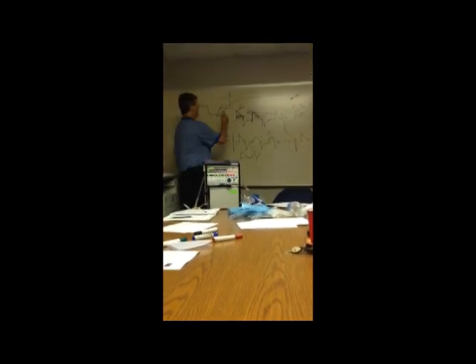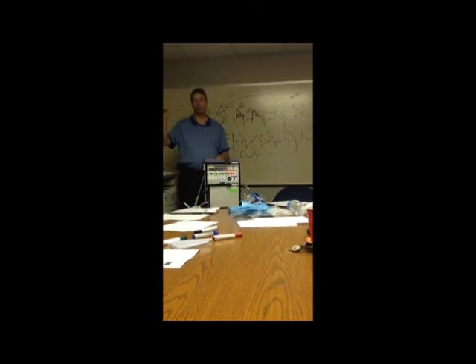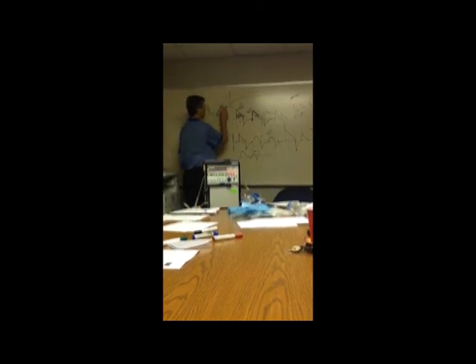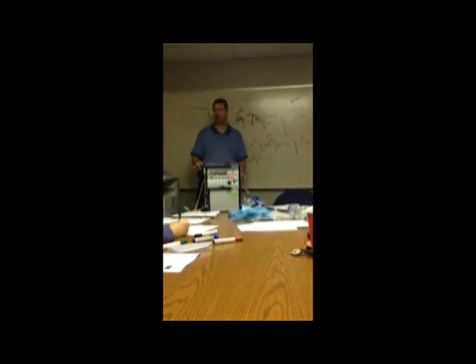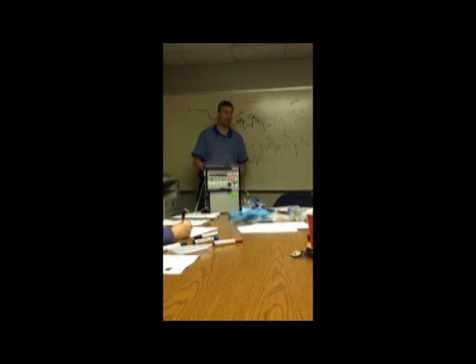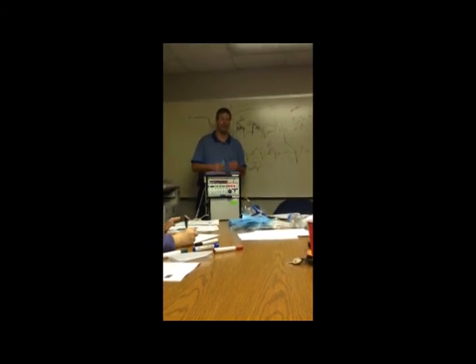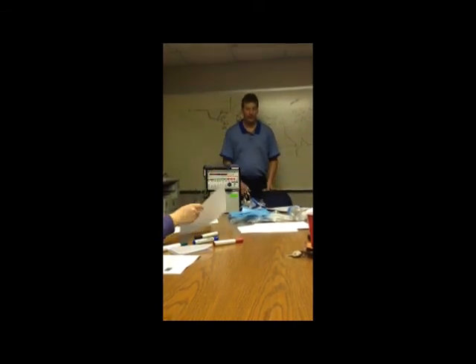If you do that, and you cut their rate up from 10 to 12, and it comes back to that level, they'll start it again. And you know, all right, I didn't go enough up on the rate. Bag them again, go up 2 more breaths. Don't make a big jump because you could end up overventilating. But bag them, put them back on with two more breaths a minute. If they do it again, take them off, bag them a few minutes till they stop breathing, put them back on with 2 more breaths a minute. At some point, you'll get their CO2 just under what triggers that funny rate, and they'll ride smooth the rest of the day. We do that in the units a lot to prevent having to put people on paralytics or on things like that. We always try that first.